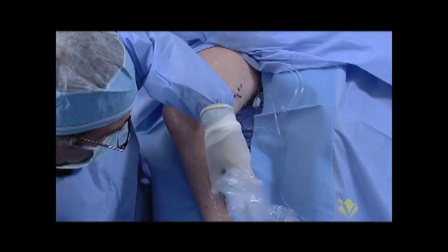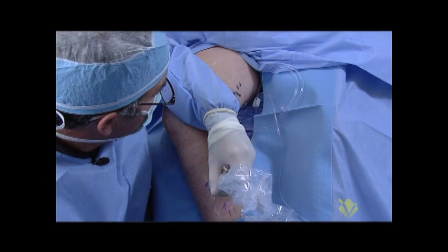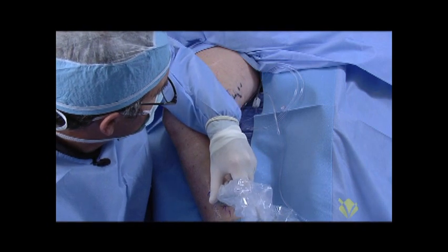In addition to that, I'm going to go down the leg here a little bit. There is a residual segment of saphenous vein that's about four centimeters in length that we're going to try to also seal — you can see it here. That's actually in the muscle there. This looks to be another perforator right there, so rather than focusing on the greater saphenous vein, I'm going to focus on this perforator right here.